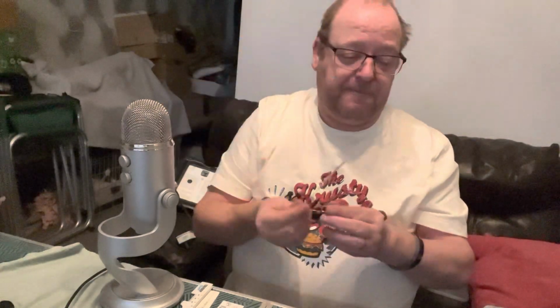My next PD ruler is very flexible. Again, it has a section so you can do mono PDs, mono pupil distance measurements, but it also tells us what the drop is on the nose. So I'll put that on, and I'll be able to tell what drop it's got to be resting on the nose. I can see what the pupil measurement is, and again, I can put it on that way and measure binocular pupil measurements.